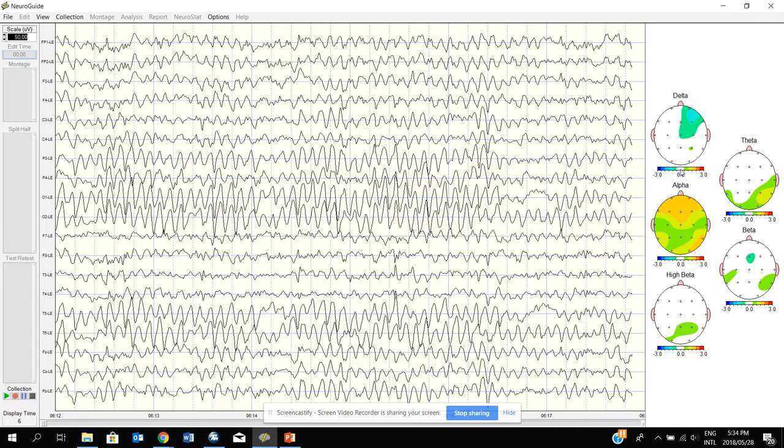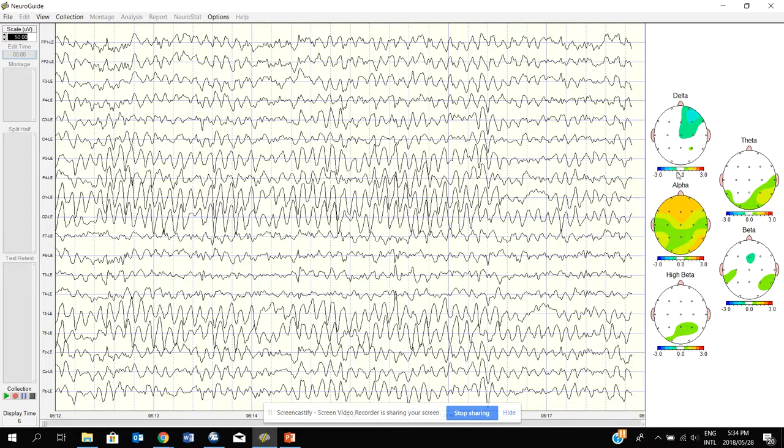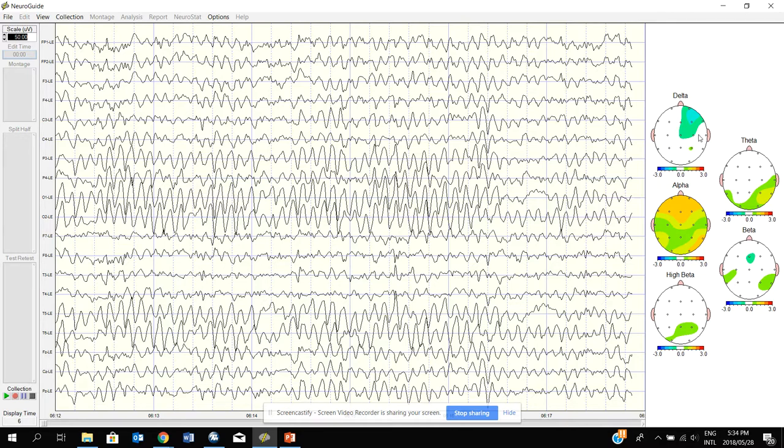The other side represents the opposite event. In other words, we're getting less and less EEG power or electrical activity from zero, going beyond three standard deviations. But already at two standard deviations, we're beginning to say this is outside the norm. So this is what I've described is just for the delta wave or the delta group of waves. But the same principle applies to theta, to alpha, to beta, and to high beta. So all these represent the categories or the frequency bands in the head.